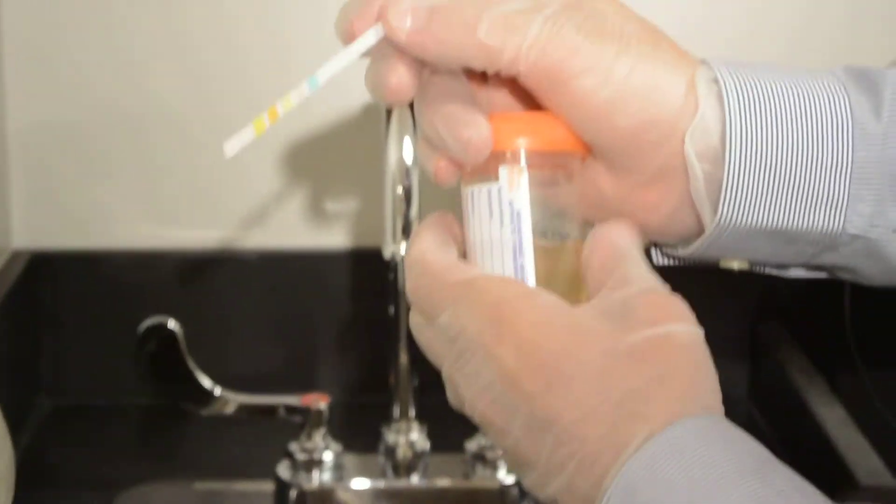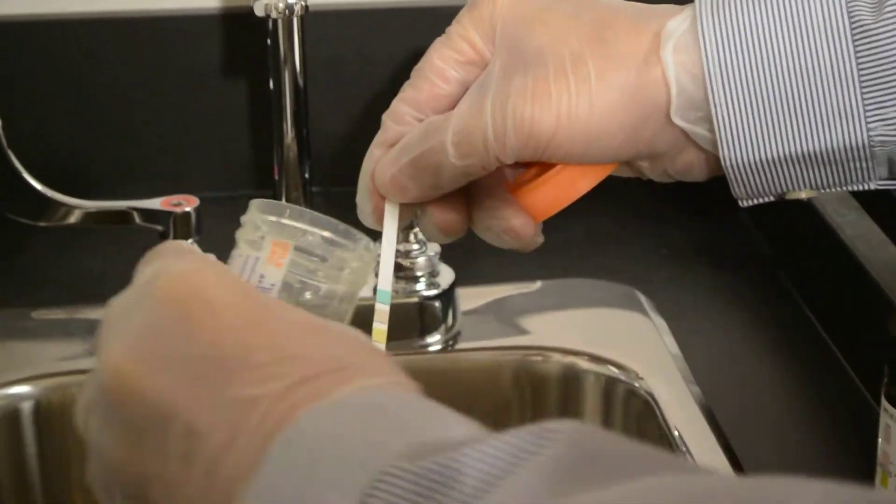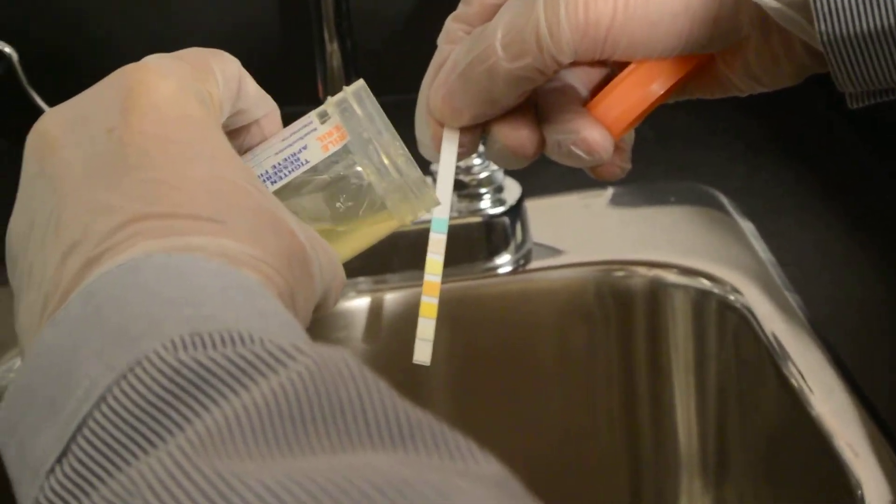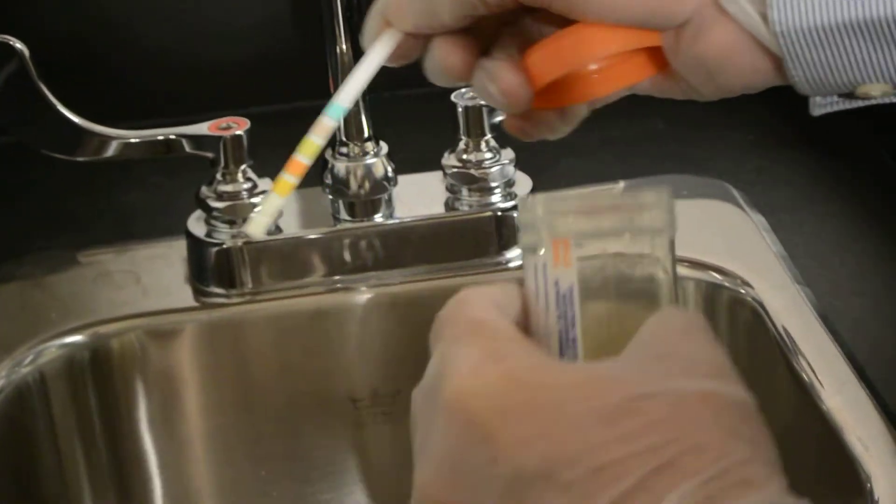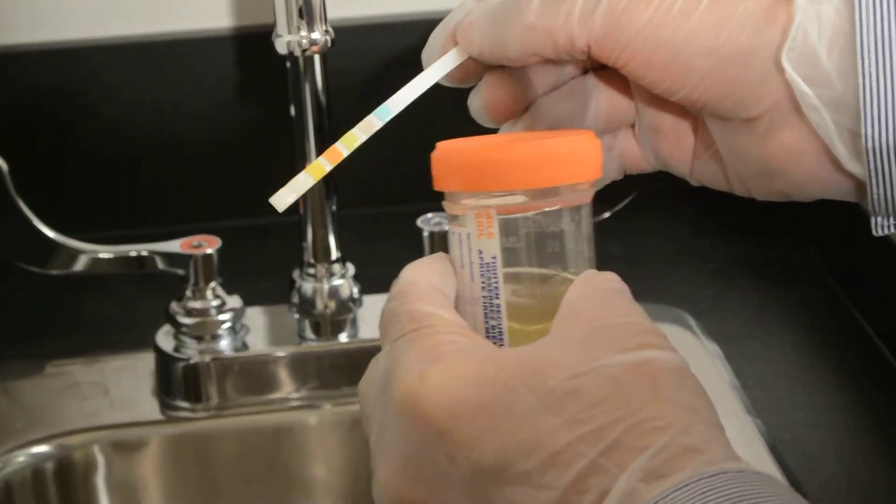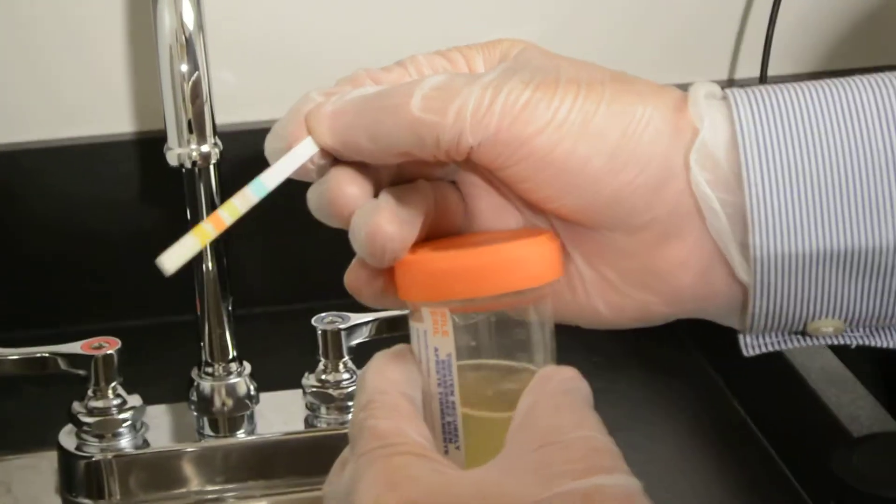You take the urine container and drip it on the strip as opposed to putting the strip inside. That's a common mistake - putting it inside the urine.